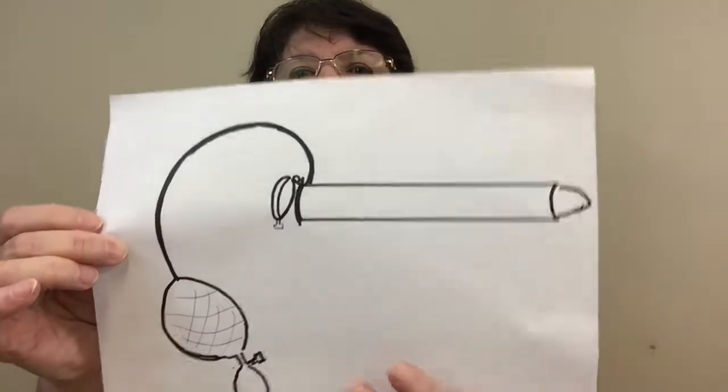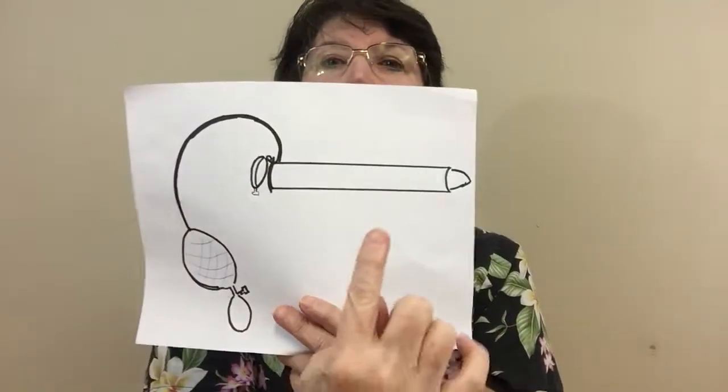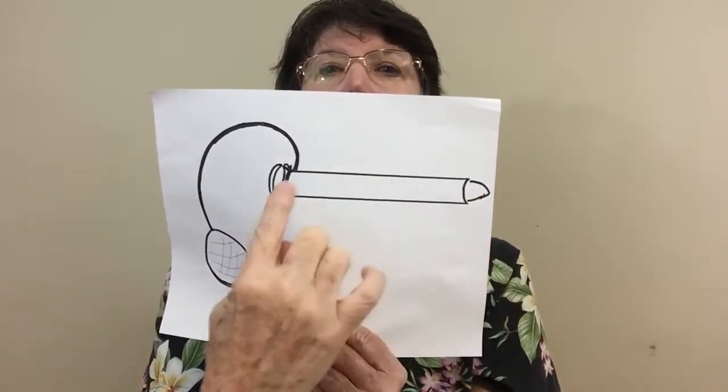Because of plagiarism rules I have to be careful what I do, so I'm just going to show you a sigmoidoscope that I drew — it should give you the idea. You have this clear sigmoidoscope, and then you have the obturator that comes in.